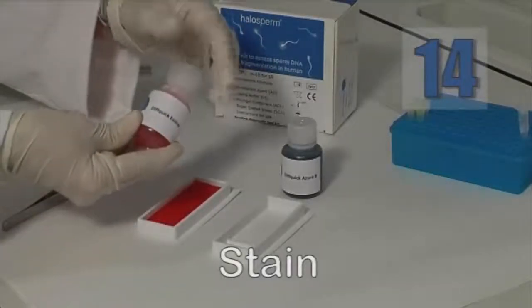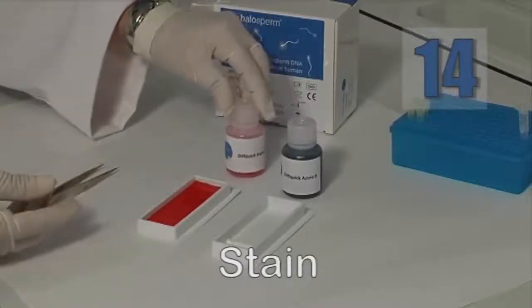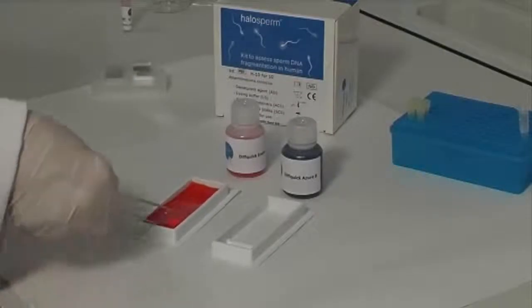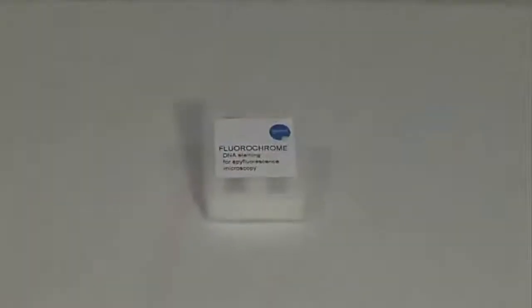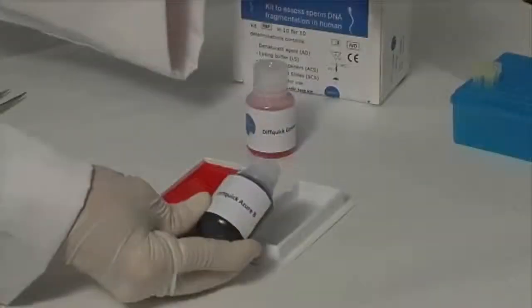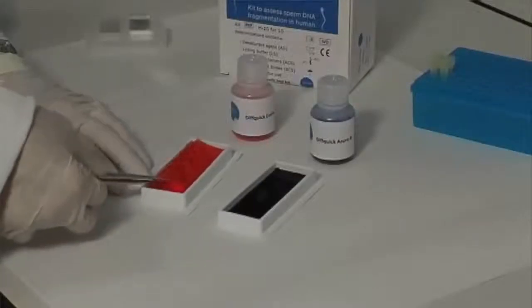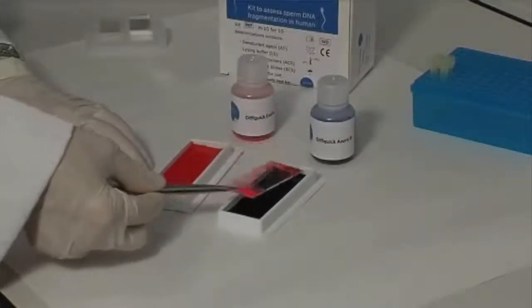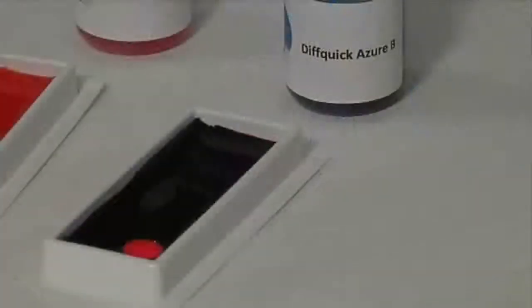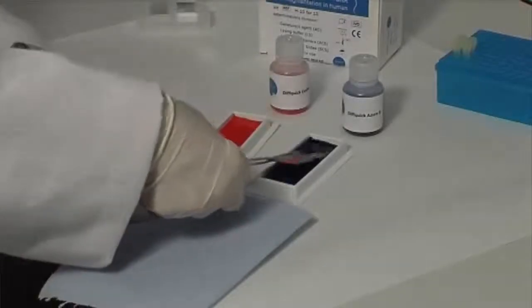The last step is to stain the slide. Use Diff-Quik for visualization under a brightfield microscope, or any DNA-specific fluorochrome for visualization under fluorescence microscopy. For brightfield microscopy, incubate the slide in Eosin for 6 minutes and then a further 6 minutes in Azure B. Leave to dry at room temperature without washing.